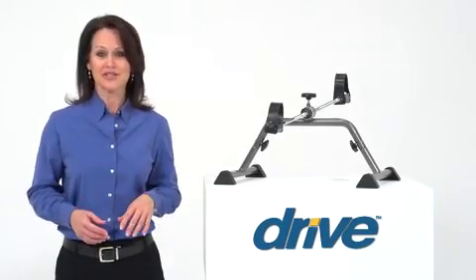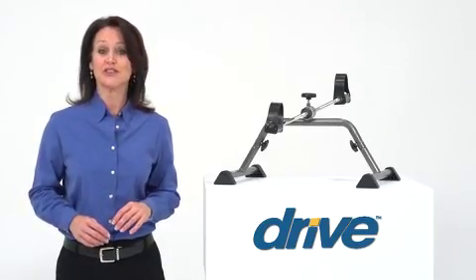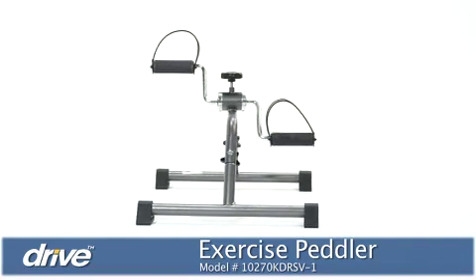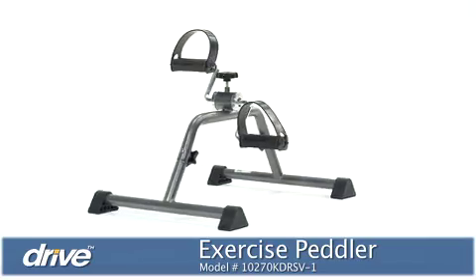Incorporating safe, gentle exercise into your daily routine can offer substantial benefits to your life and health. For people who prefer or need a low-impact activity, Drive Medical's Exercise Peddler is an affordable, convenient option.